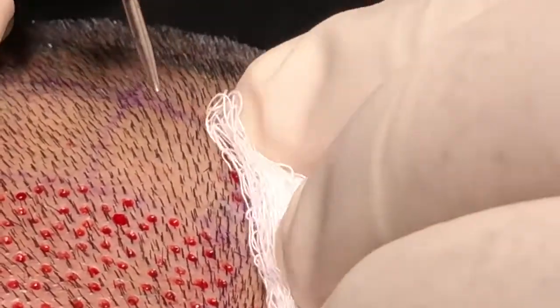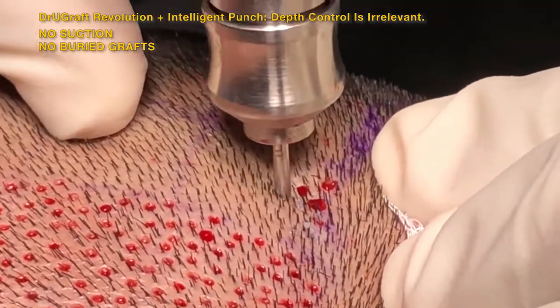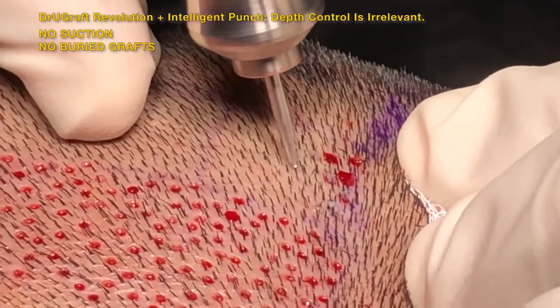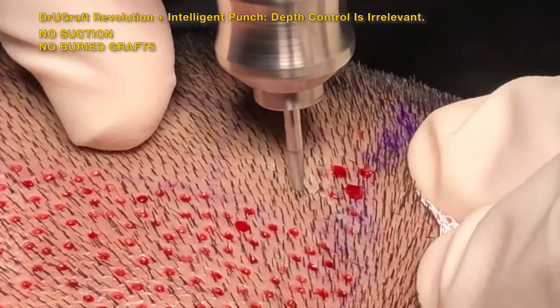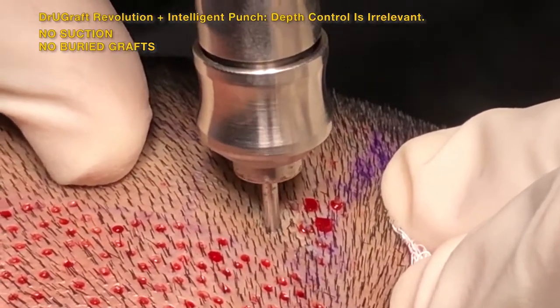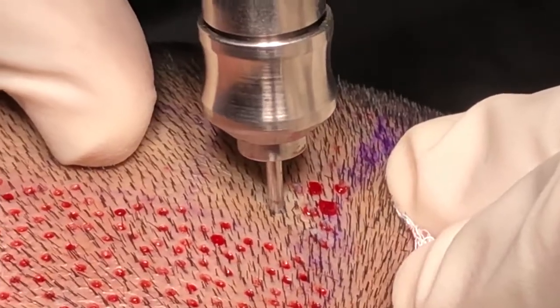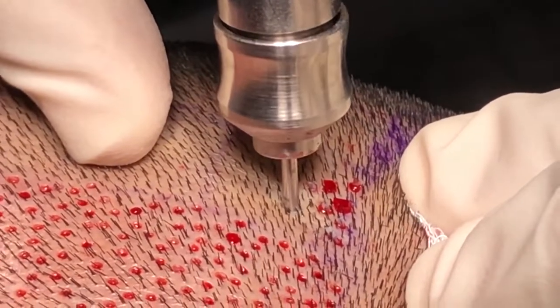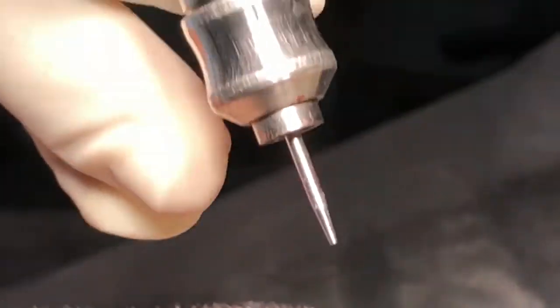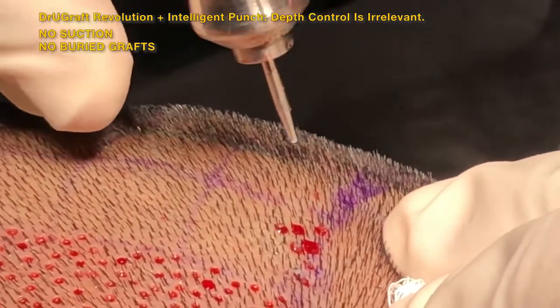With the Dr. U Graft Revolution coupled to the intelligent punch, the practitioner doesn't have to worry about manually controlling the depth of the punch. The smart design of the Dr. U Graft intelligent punch increases the resistance on the punch as it goes deep, resulting in slowing down the rotation to a point where it slows or stops at a certain depth, avoiding cutting the graft and causing no transection.